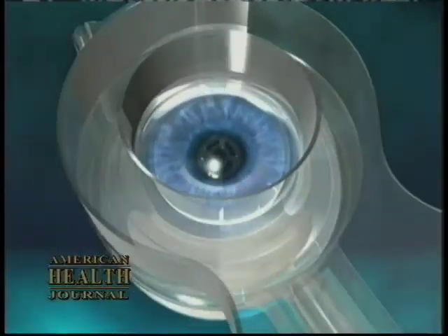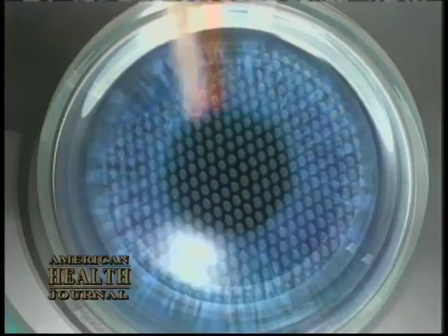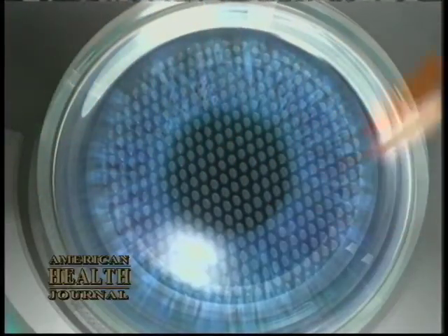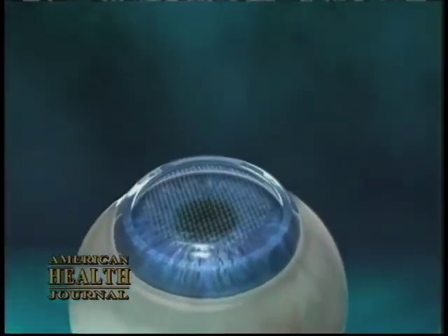There are really two lasers that are used to perform the LASIK procedure. The first one is called the Intralase, and it's a laser which actually creates the flap. That's the first part of the laser vision correction. We create a flap in the cornea. It's all done now with laser technology. The laser is much more precise and accurate, and actually we can now create very thin, accurate flaps and do patients who couldn't be done in the past.